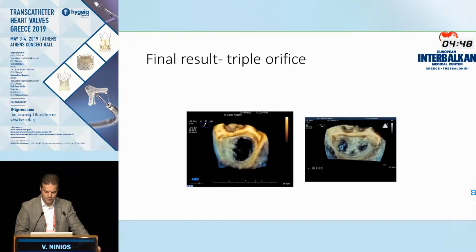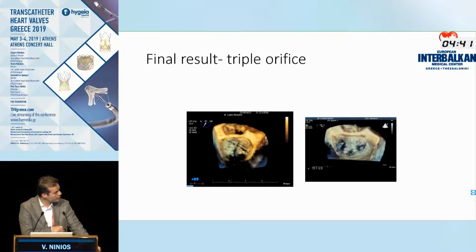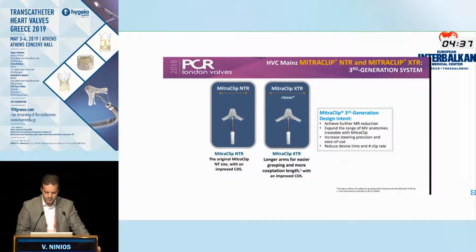So by putting the 2 clips in a V-wave fashion, like that, you can create a valve with 3 openings, 1 laterally, 1 medially, and 1 in between the clips.